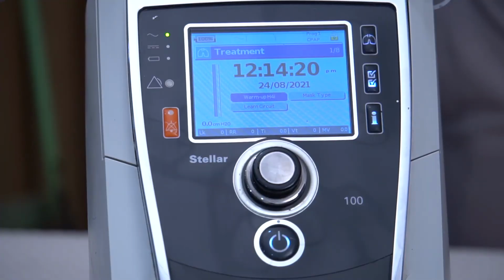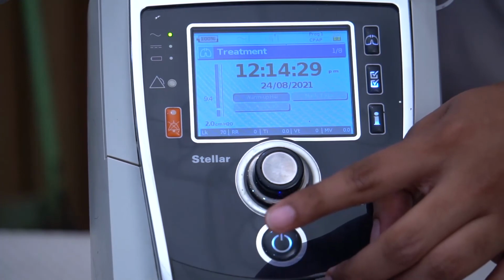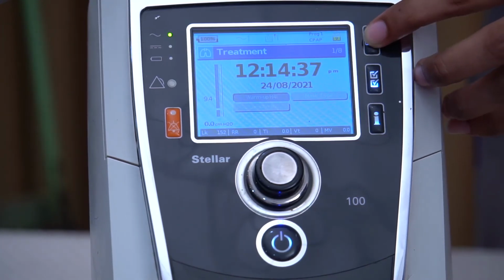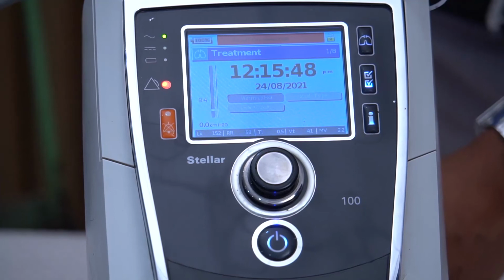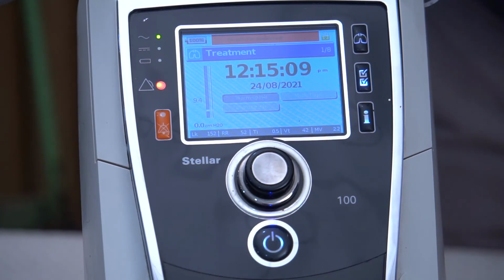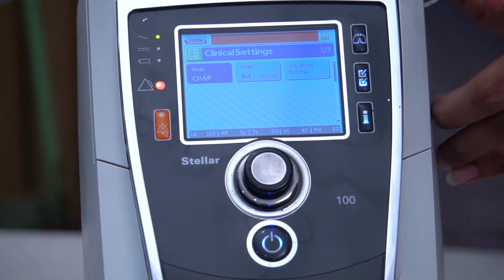How to start ventilation? Once everything is set, press the on-off button on the upper surface to start ventilation. Then you will feel the airflow via the face mask. Once you press the double lung sign button, you will see this screen. Here you can see the dynamic pressure indicator on the screen. If the indicator column is not rising to the set pressure, then you need to check for leaks and oxygen supply. If you want to change the settings during the therapy, press the button with the double tick sign. Then you can change the settings.